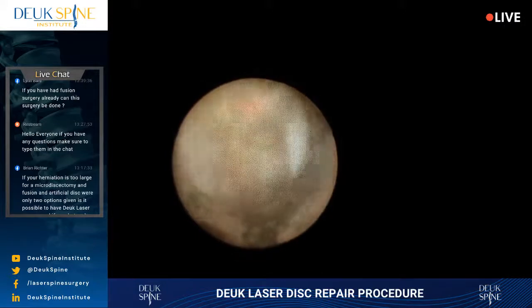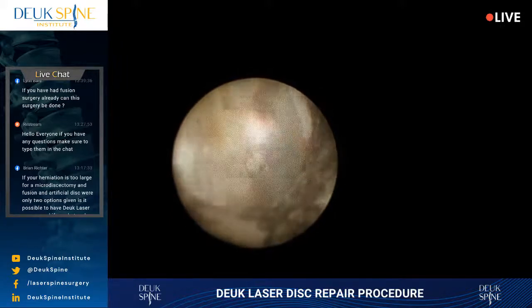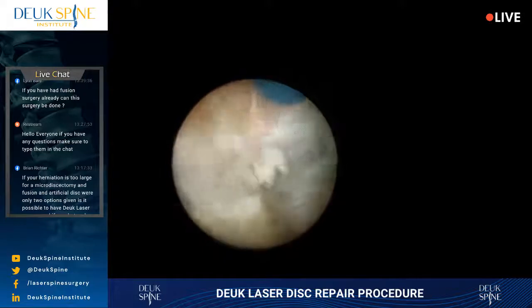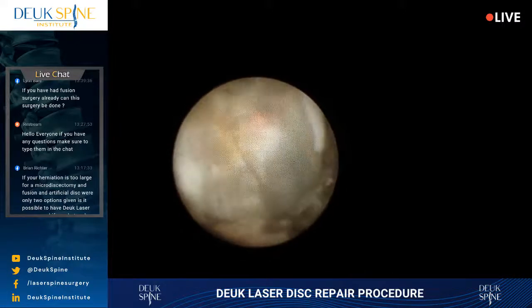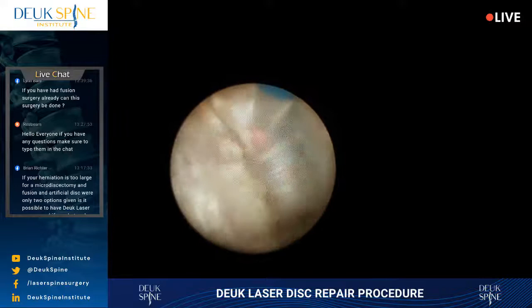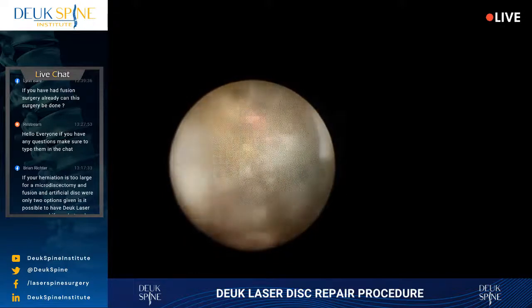What I'm clearing away, this is the annular tear. So the annulus ends, and behind the annulus is the posterior longitudinal ligament. And the PLL is those white fibers there. And below that is the spinal cord, the dura. Okay? We call it no man's land. No man's, no woman's land. We don't want to go there. But I need to make sure I'm not leaving anything. Pretty cool view, huh?